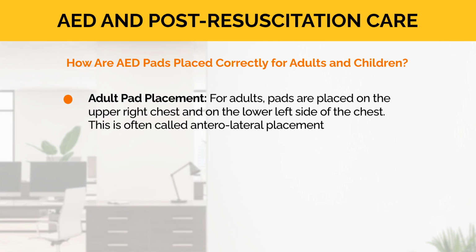Adult pad placement. For adults, pads are placed on the upper right chest and on the lower left side of the chest. This is often called anterolateral placement.